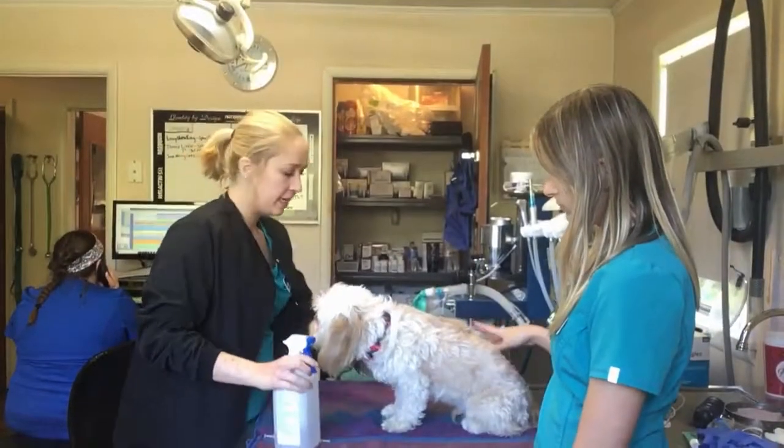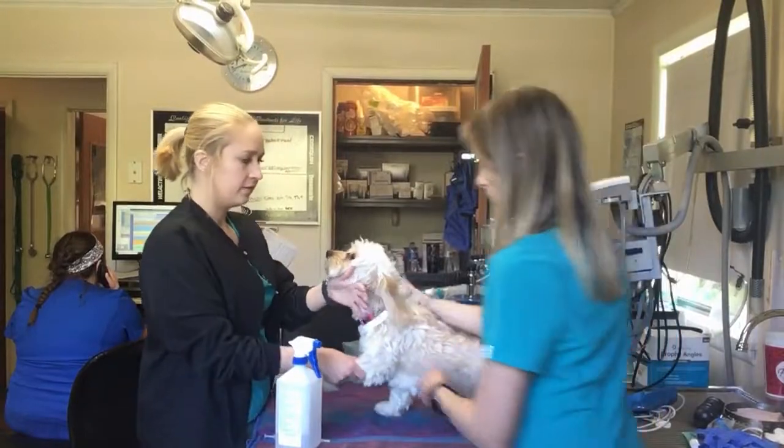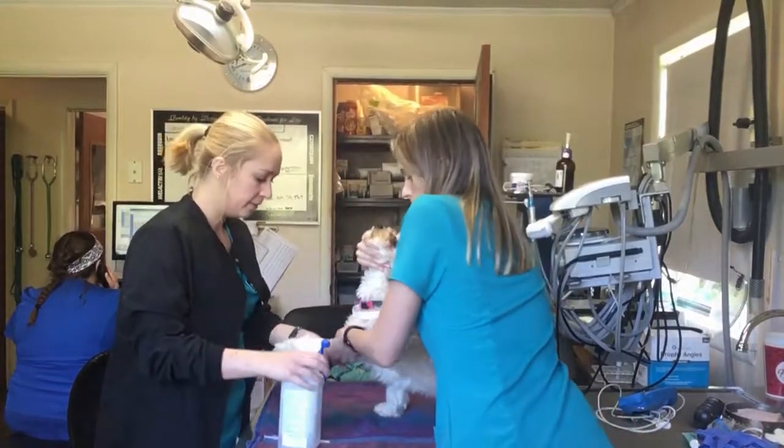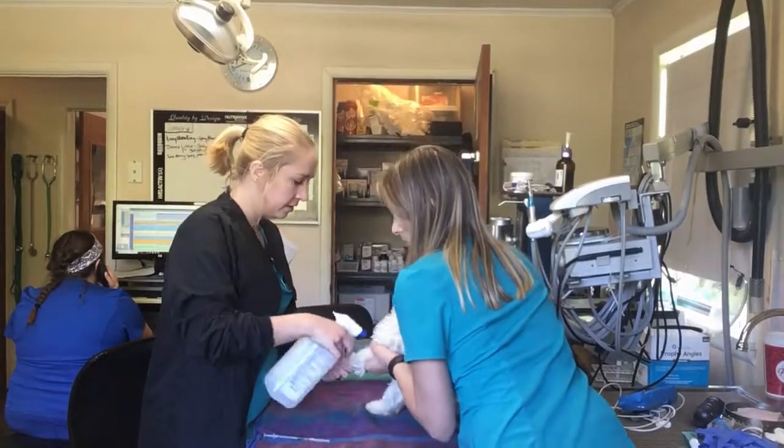Alright, so we're going to go ahead and induce Miss June for her spay today. We're going to be inducing her with Telazol IV.